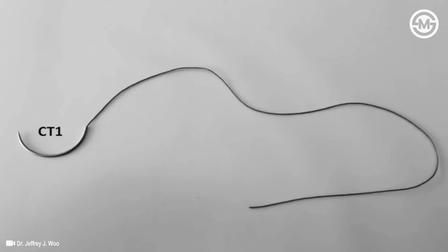Throughout this presentation, we will be using a CT1 needle connected to 15 centimeters of O-bicryl. Each needle has a tip and a hub. We will further divide the needle into three points. Point A will be the point on the suture approximately 2 centimeters from the hub — this will be our first grasping point.